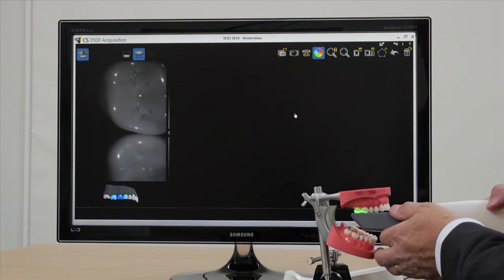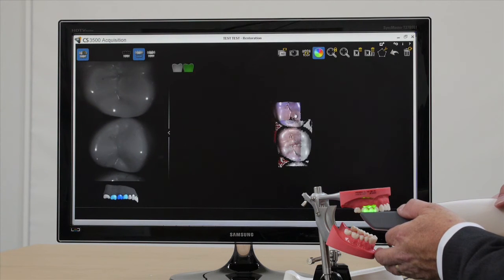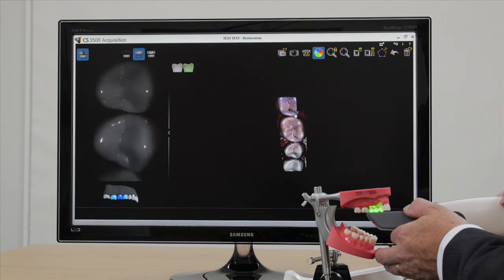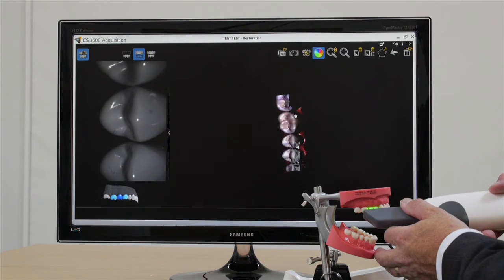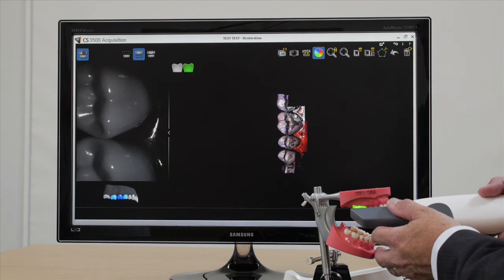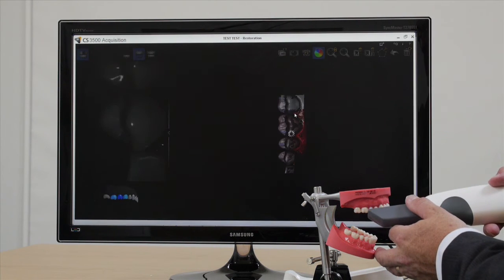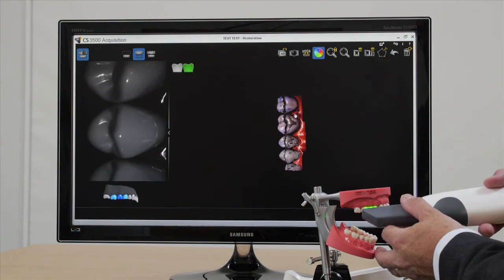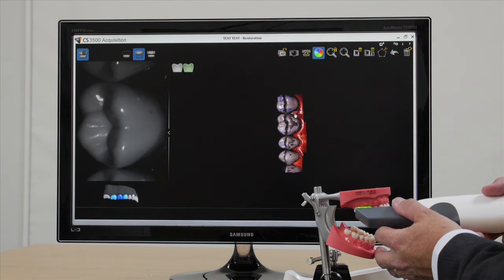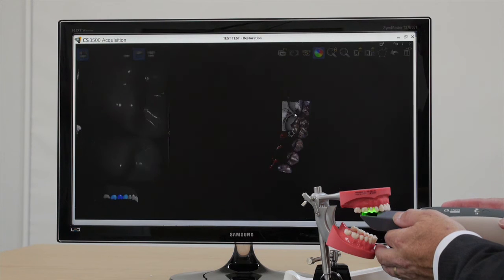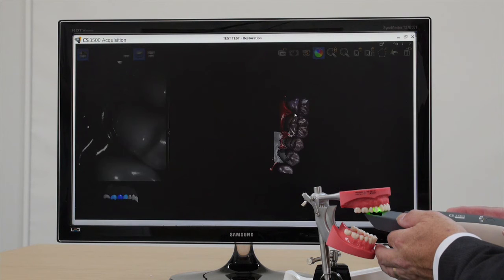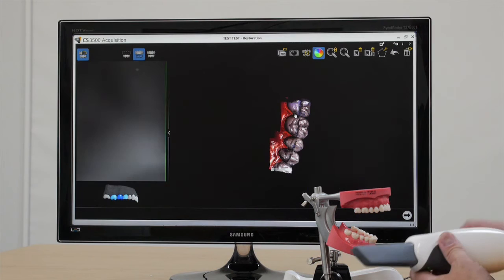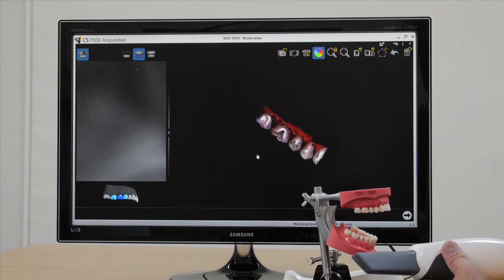So I'm now holding it on the occlusal surface. I'm now starting to take my images. And then after this occlusal scan, I will move down the buccal side. And you can see the buccal images starting to be filled in. You can also adjust the settings, the speed of acquisition of this scanner. That's a personal preference. Entirely up to you how fast you want the system to be. Now I'm going to go palatally. Let's take a few pictures there. And again, entirely up to the clinician whether you need full arch or not for your case. So let's say we're happy with this.